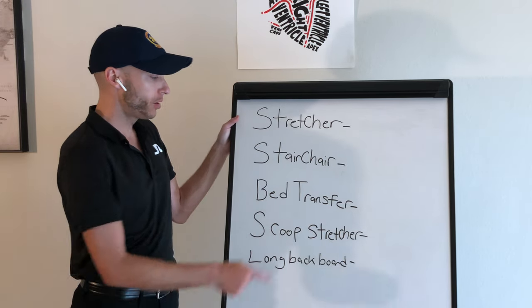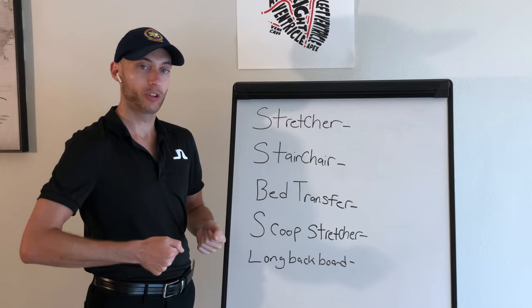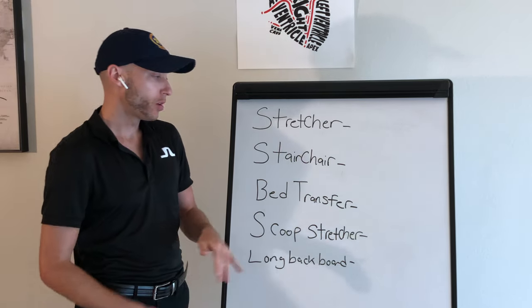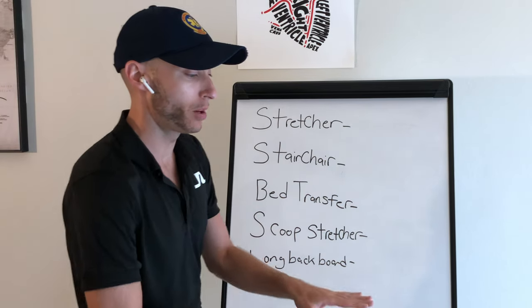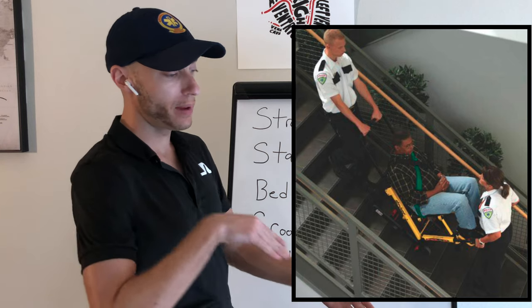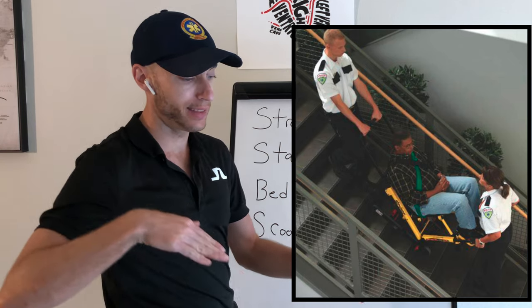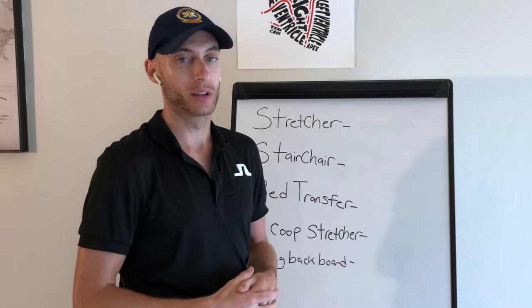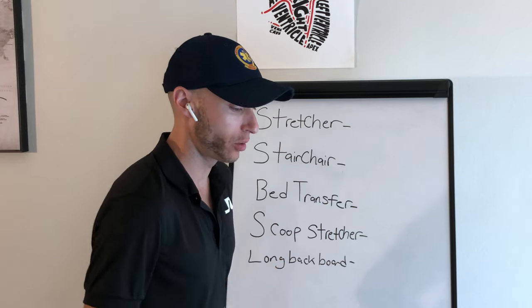For the stair chair, there are two main modes: we can lift the patient and carry them down the stairs, or we can glide down the stairs. Whenever you can glide, there are tracks to open up and glide down. There's not much work to be done — you just have to maintain the proper tilt going down the stairs and hold it at that angle. You're gliding the patient down, though you still need to be in a secure stance.